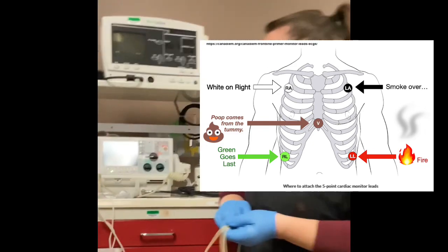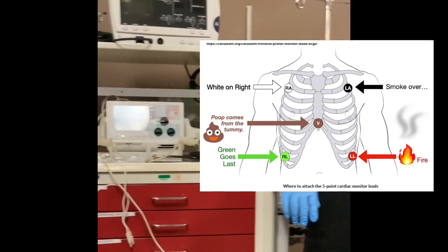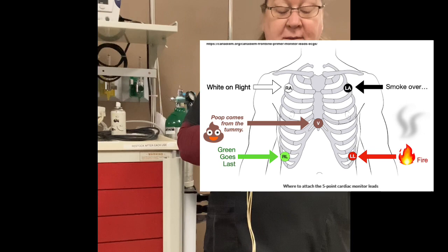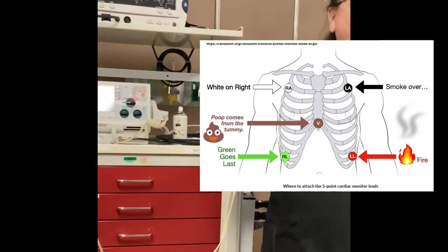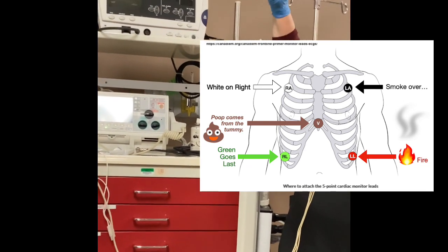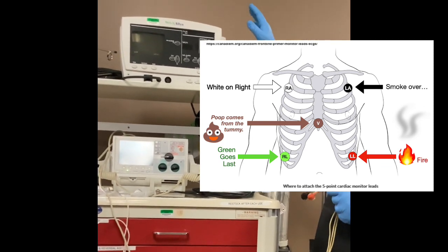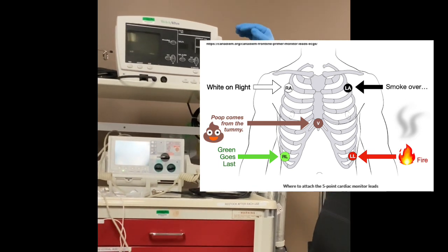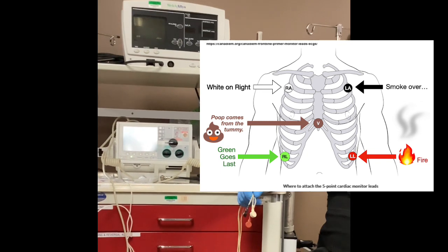So a patient comes in to the emergency room and there's something going on. We're going to put 3 leads on the patient originally. You need to understand the distinction between a 3-lead ECG monitor and a 12-lead. A 3-lead monitor is the monitor on the wall in the room. Every patient in the ER, in an ICU, or on telemetry where they monitor their heartbeats is going to be on that kind of monitor. So it's pretty much standard procedure when coming into the ER.